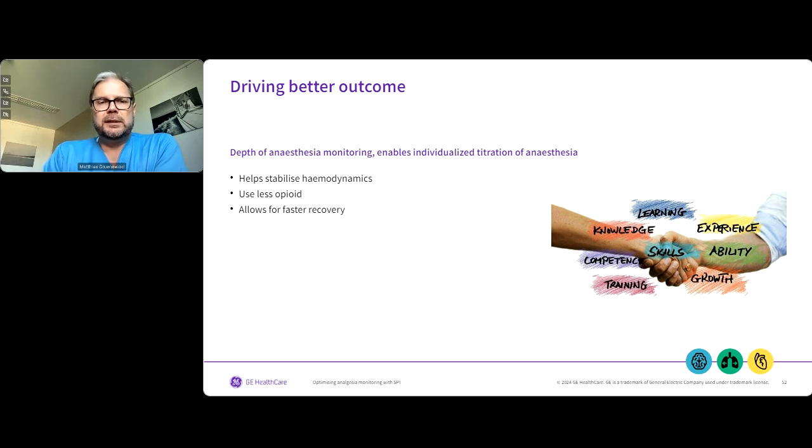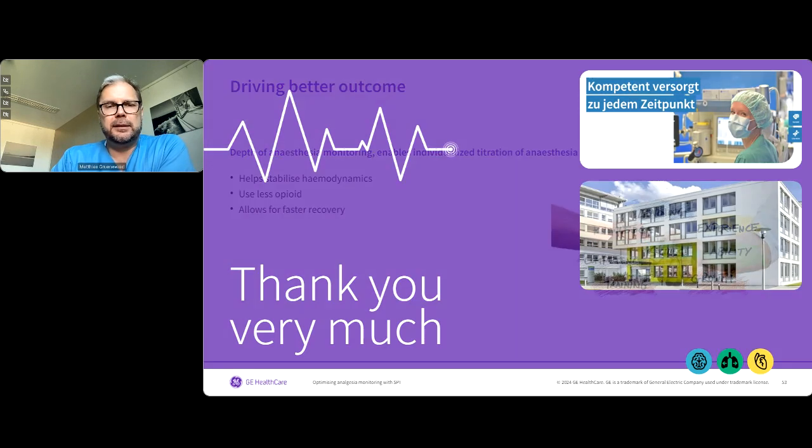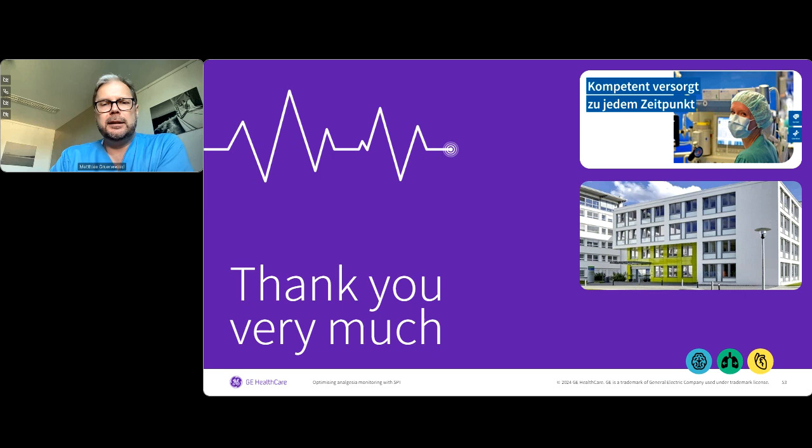My experience is that we as anesthesiologists tend to use a lot of opioids because of the cardiovascular effects, but we can use less opioids by monitoring the nociceptive component, and almost all studies show that we have faster recovery in patients where we have depth of anesthesia monitoring in place. I thank you very much for your attendance, and I'm open now for your questions. Thank you very much.